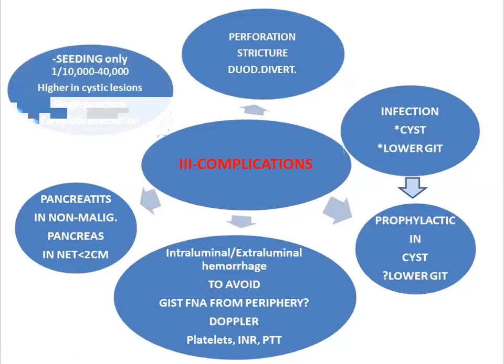translocation of malignant cells, higher in cystic lesion. In cystic lesion, try to do a single puncture and to do complete evacuation of the cyst to decrease the pressure inside, to prevent oozing of some fluid in the nearby tissue, to minimize seeding.